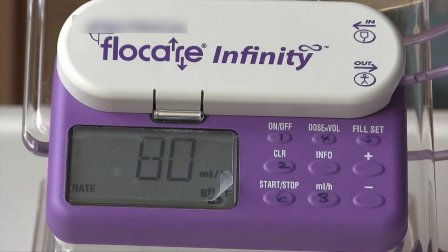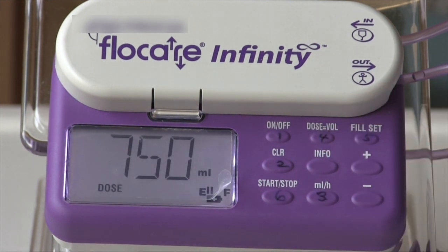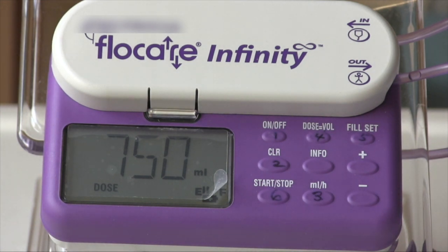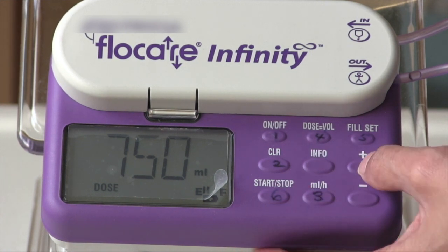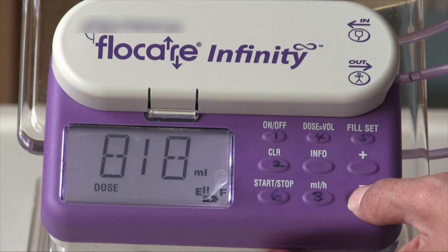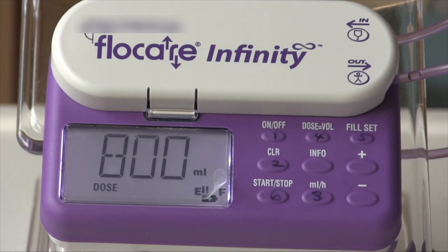Next, you will program in the dose. So you'll press the button that says dose equals volume. This is the total amount of feed that you will be getting throughout the day. For this example, we can set it to 800. Again, it's dependent on your own feeding regimen that you will be given by the dietitian as to how much you will be given. Again, you'll want to hold down the plus sign to get to 800. If you've gone past, you simply hold the minus sign and go back down. And there you've set the dose.